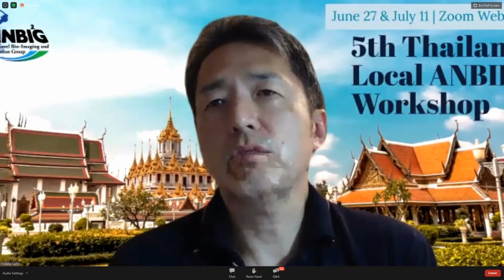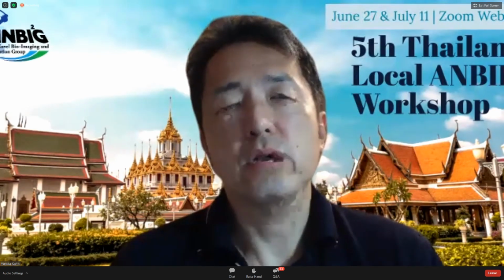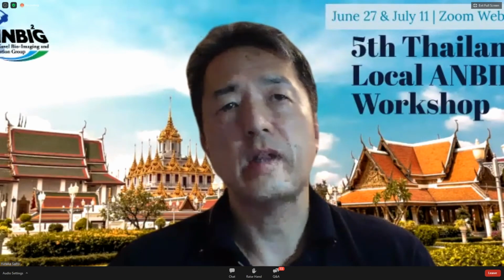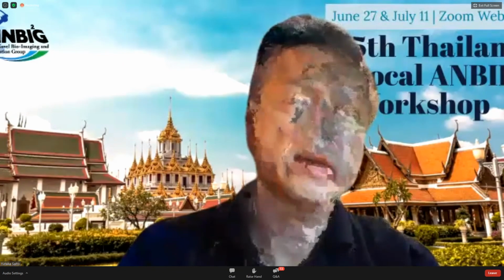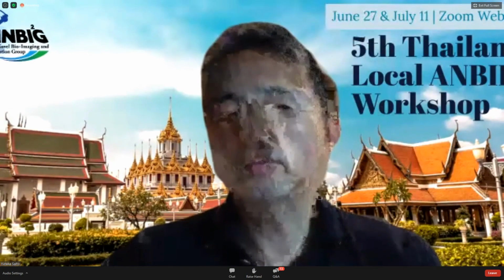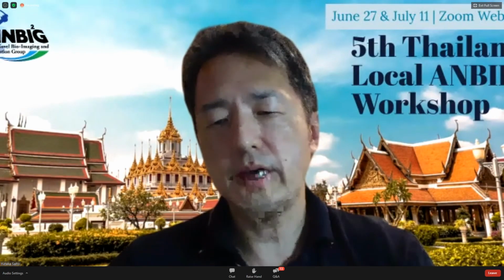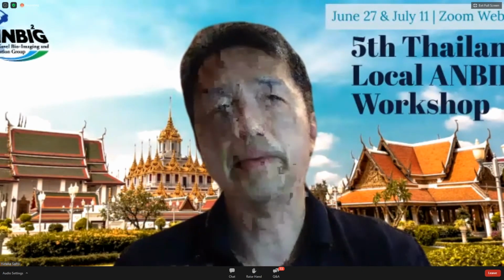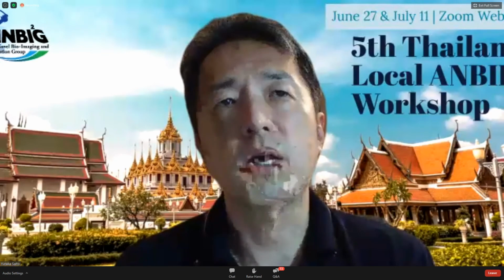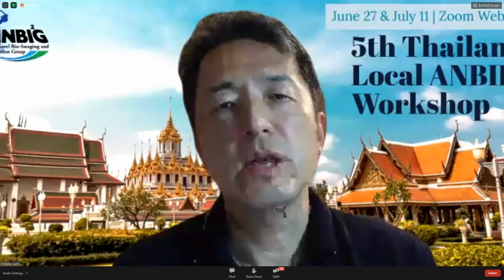Another point is that endocytoscopic diagnosis is really good for AI diagnosis, artificial intelligence, because the endocytoscopic image is 500 times magnification and a contact image. The endocytoscopic image is always in contact with the tumor surface, and the focus area for the AI technology is always the same. That's the point. The endocytoscopic image is good for AI technology, and the EndoBRAIN is now commercially available in Japan and in some foreign countries. So if you would like to use AI diagnosis, the endocytoscopic image is good.